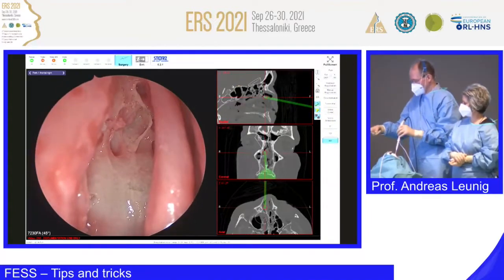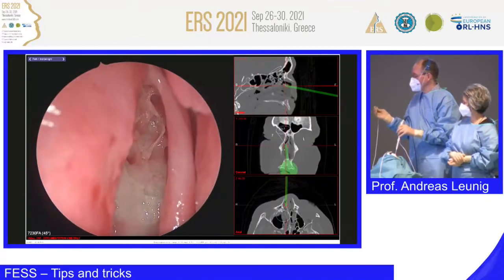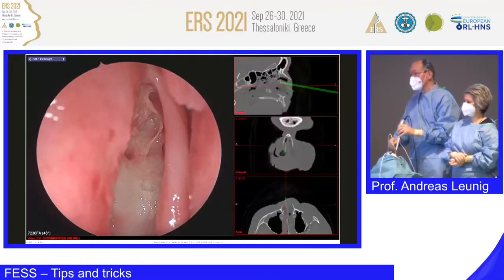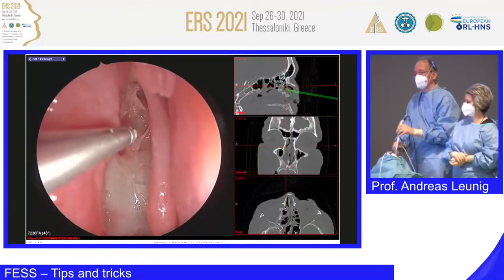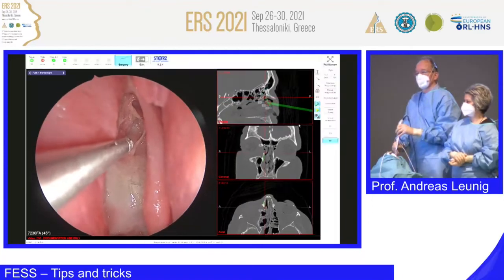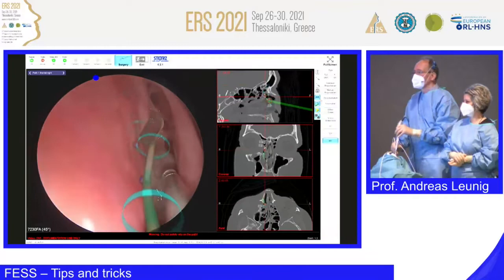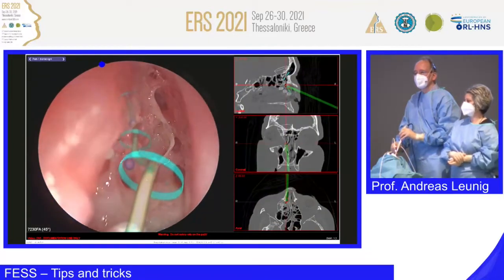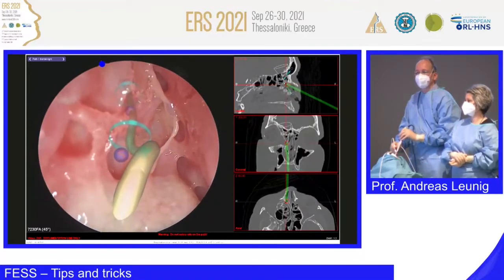Okay, thank you. I'm getting the individual bent probe, which we can use now. Please draw in the path, can you see it already? Okay, so. Now, where to go up into the frontal sinus? This must be up there, the direction. Isn't it nice? So we will see a bit later.